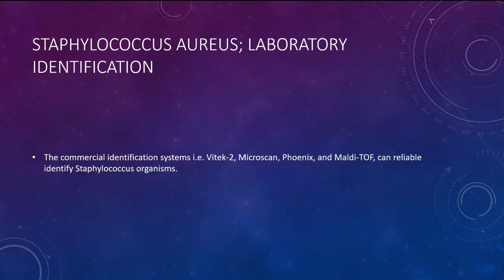Moving on to the identification, nowadays the commercial ID systems from Vitek, Microscan, Phoenix, and the latest MALDI-TOF, they are able to reliably identify Staph aureus without any doubts.